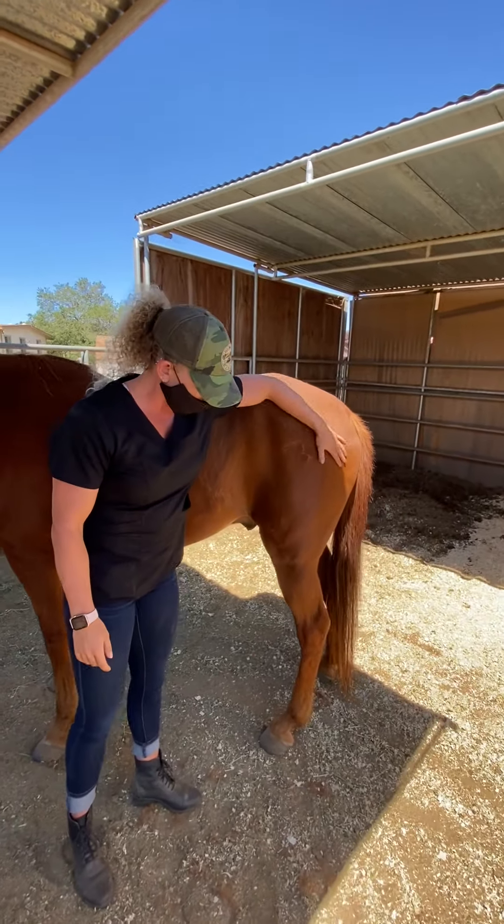So again — cervical spine, nuchal ligament — you just want to envision a big triangle up here. What is recommended is to grab an area along the side of where you're going to inject so the horse is distracted and knows you have something there.